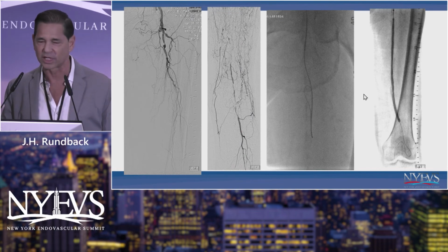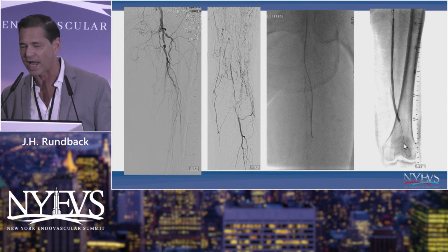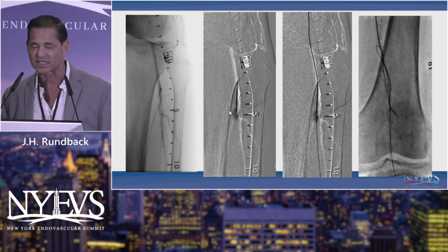Let's keep going through these really quickly. Here's a patient, long SFA CTO. I'm going to keep saying that. Here we go. Now we've dilated up the track. We're sort of trying to find our way back in. Not successful. Again, there's another retrograde P3 puncture.